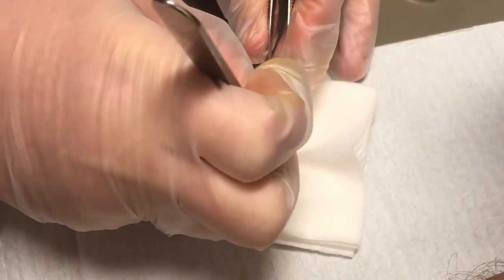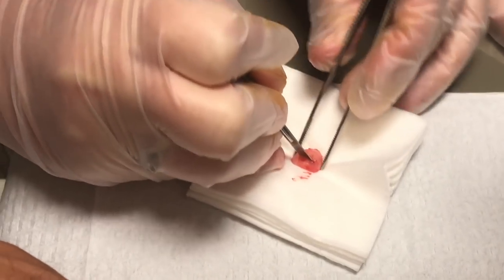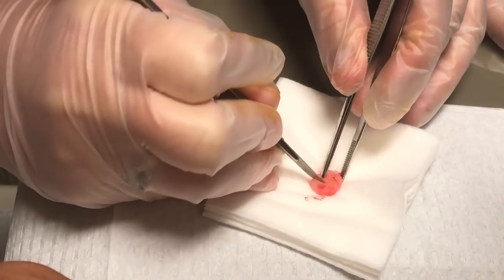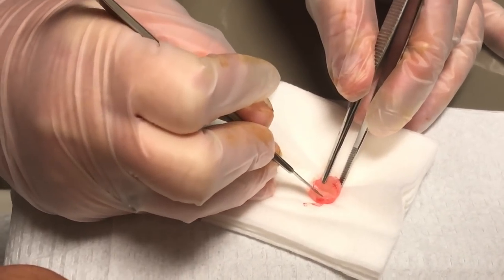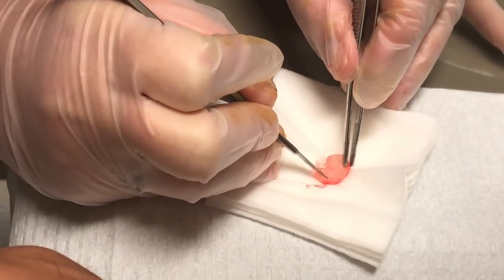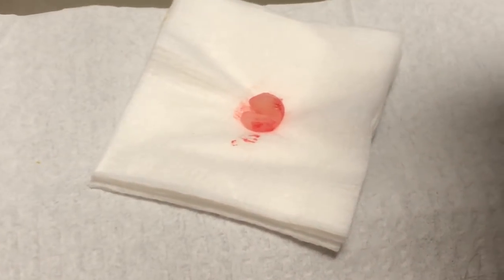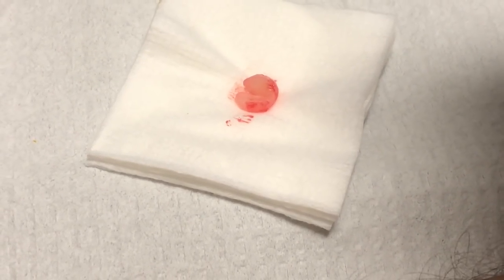We have a huge mass. Oh geez — did you hear that? It's very, very fibrous. It's more solid than gelatinous — completely solid. It looks kind of like a grape.